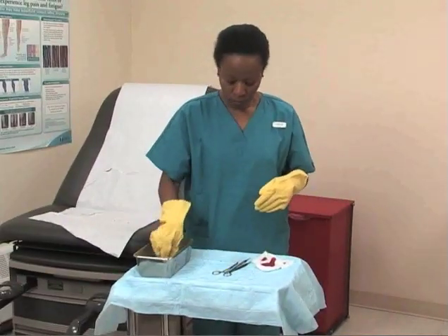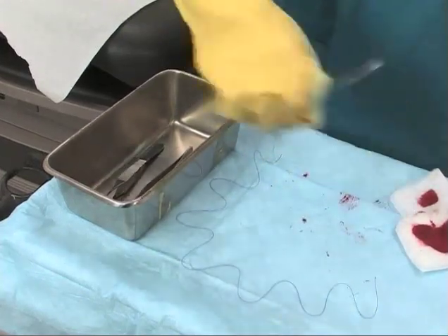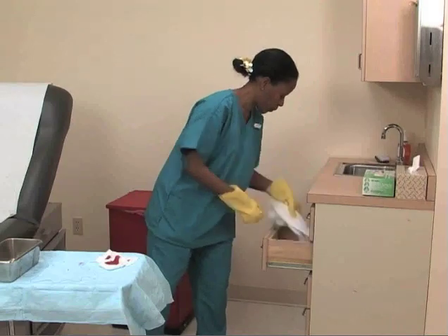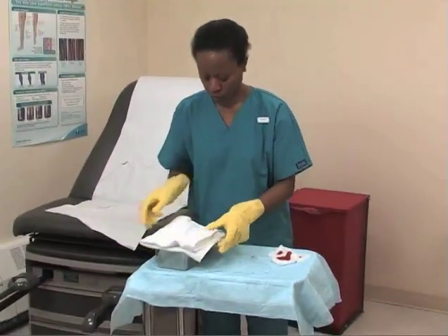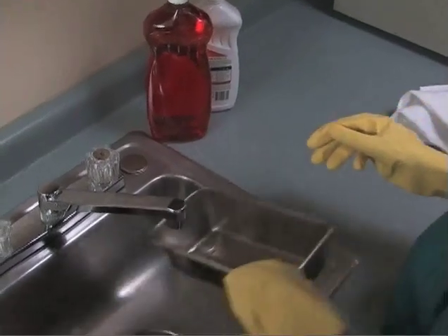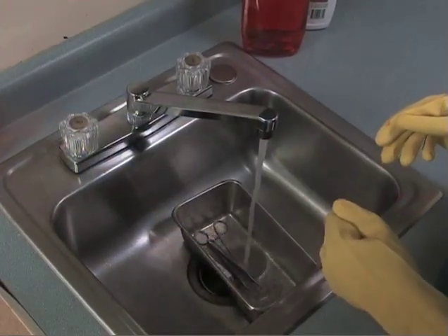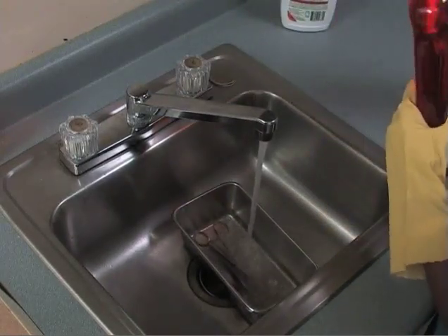Place the contaminated instruments in an empty basin, cover it with a cotton towel, and carry it to the cleaning area. In the cleaning area, uncover the basin, add disinfectant or water with detergent to the basin, and allow the instruments to soak. Always soak the instruments immediately to prevent blood and tissue from drying on them.